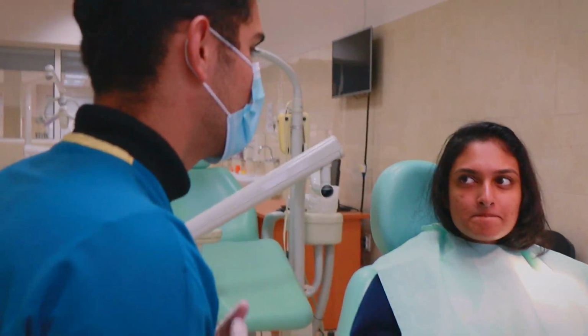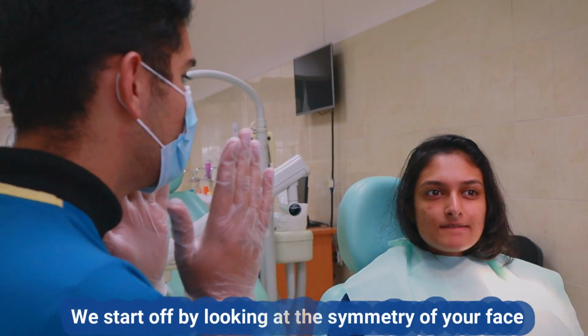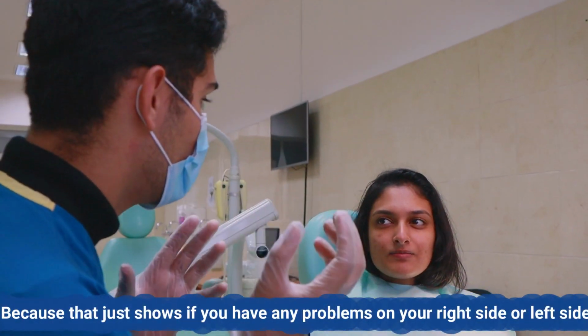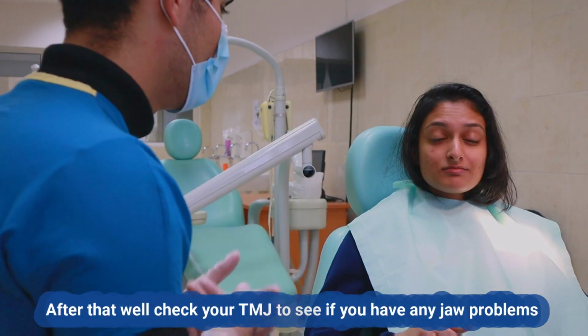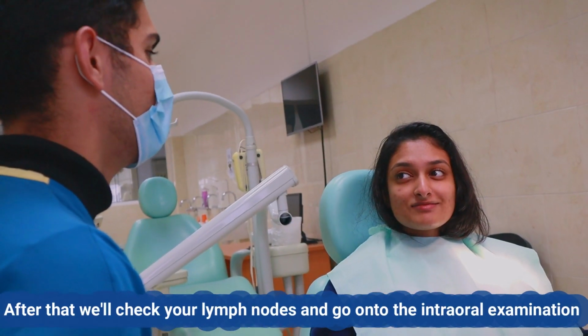Firstly, the extraoral examination. We start by looking at the symmetry of your face, because that shows if you have any sort of problems on your right side or left side. After that, we'll go into checking your TMJ so we can see if you have any jaw problems. And after that, we'll check your lymph nodes, and from there, we'll go into the intraoral examination.